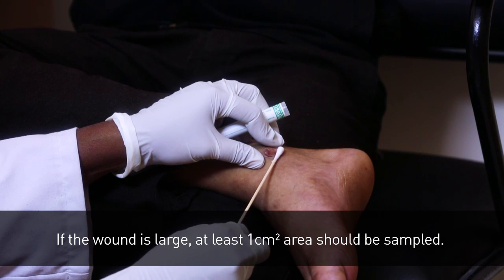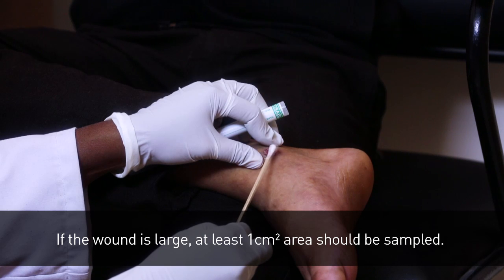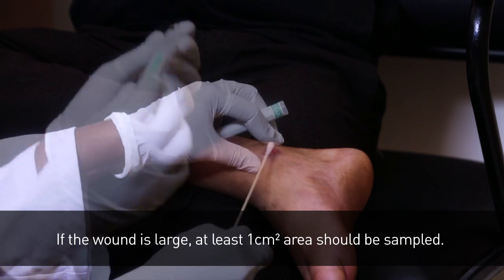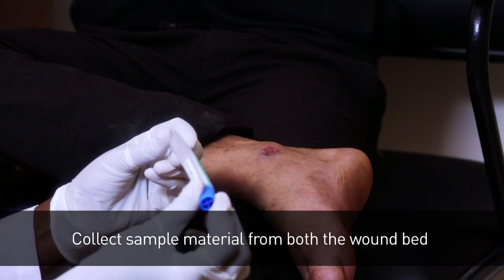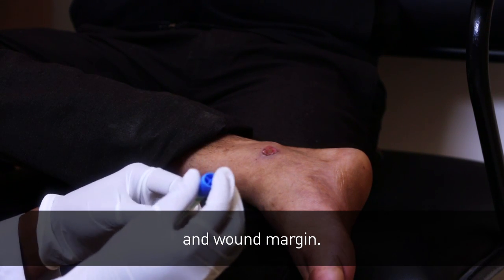If the wound is large, at least 1cm square area should be sampled. Collect sample material from both the wound bed and wound margin.